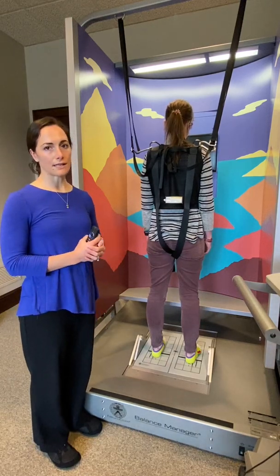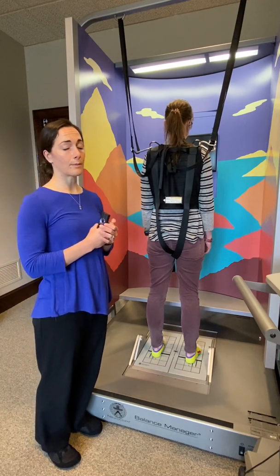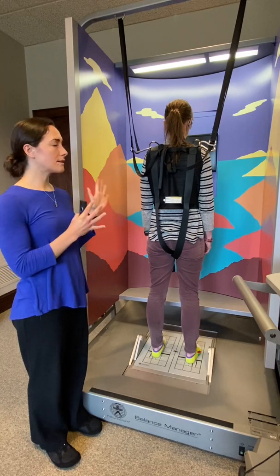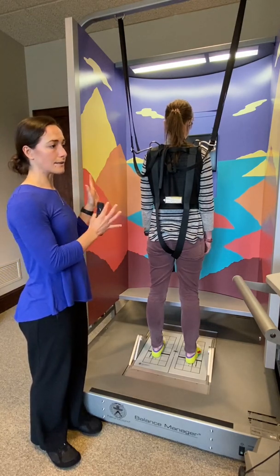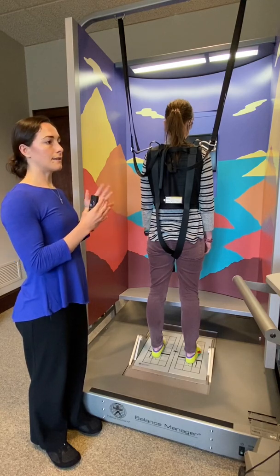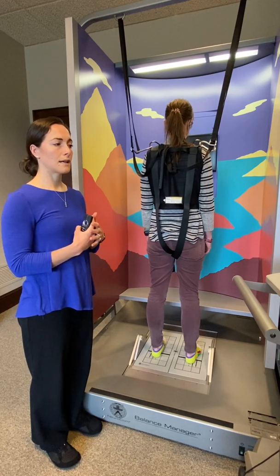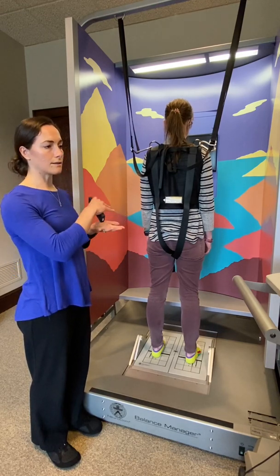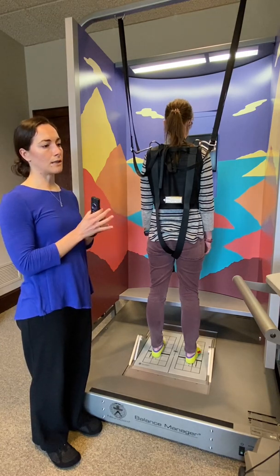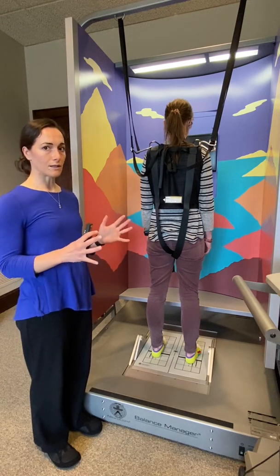This is the sensory organization test, the first test we usually do during computerized dynamic posturography balance testing. The first condition is the patient standing as still as they can with eyes open for 20 seconds. The second condition is standing as still as you can with eyes closed for 20 seconds. The floor continuously assesses weight shifting to determine how you're using your hip and ankle strategies and how well you're able to balance.